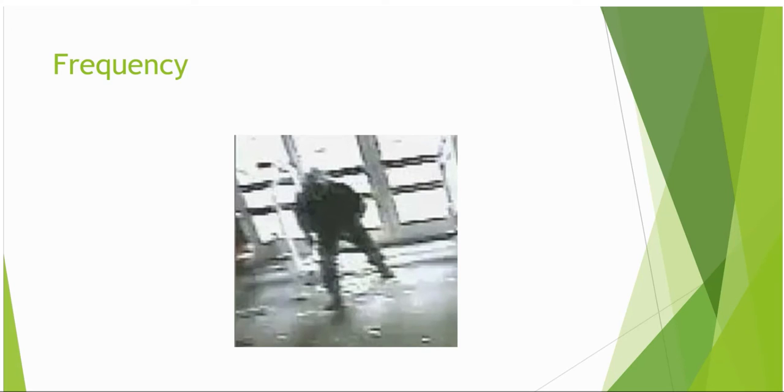The lower the frequency, the lower the spatial resolution. As seen in this CCTV image, the lower resolution does not allow to identify who the intruder is. Higher resolution settings would be desirable.